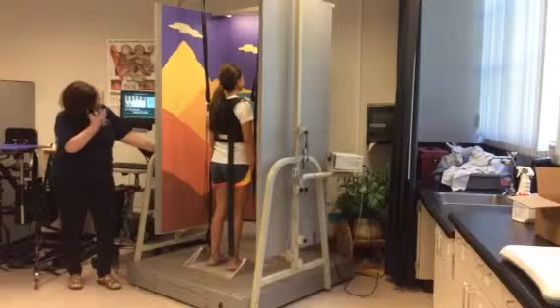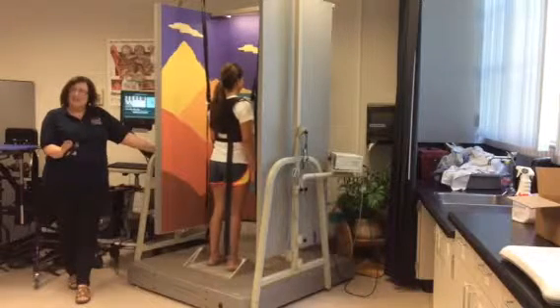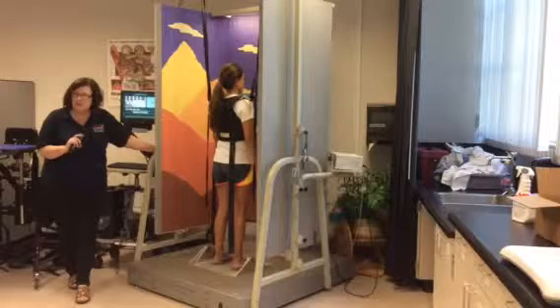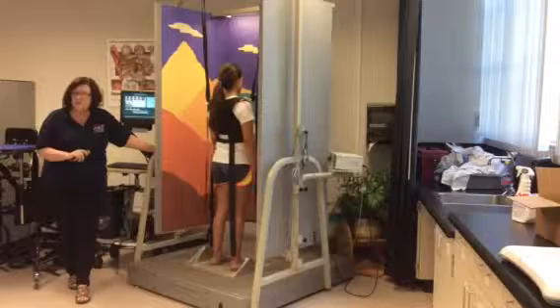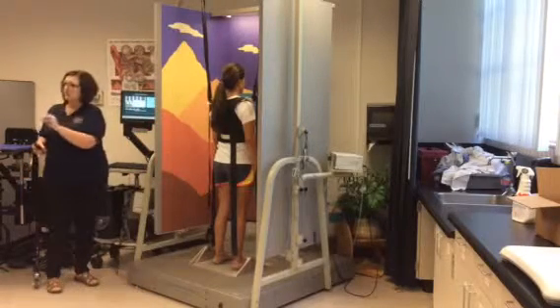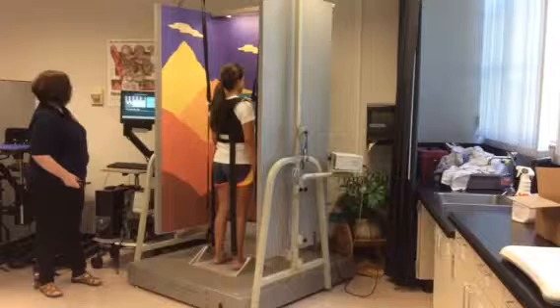So this one's not reflex anymore, right? This is actually automatic. If I put an EMG on her gastroc and soleus and I actually measure the stretch and the response time from the muscle, that would be reflex. And I can do that. That's what that is. So if I want to know the integrity of her stretch reflex, I can measure that. And then I go the other direction.